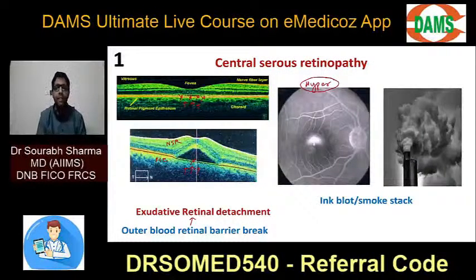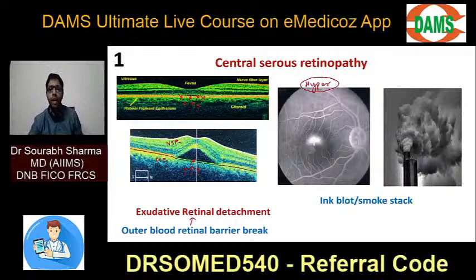Everyone good. This central serous retinopathy. On angiography, what will happen? There is a central hyperfluorescence. Hyper, dye is rising up. And central, there is dye because of the outer barrier break. What is the clinical question here?